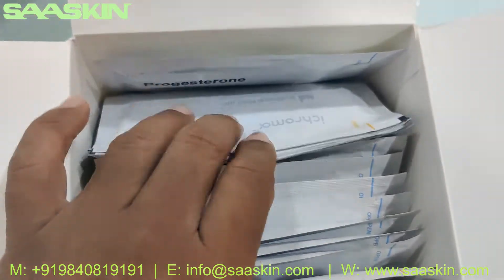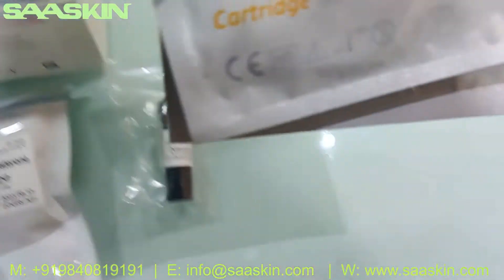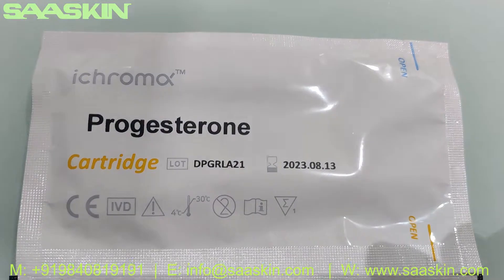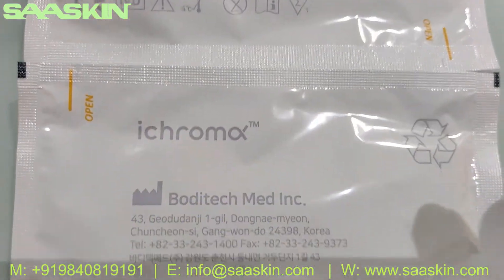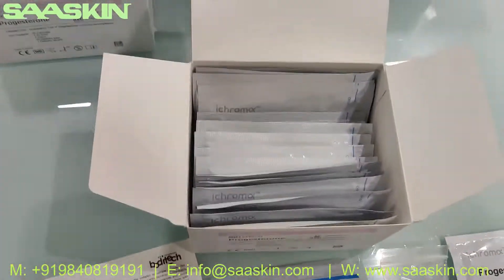Inside you can see — this is a 25-test kit pack, so you have 25 cartridges here. Let me take out two cartridges so you can see how the cartridges look like. So you've got the 25 cartridges here.